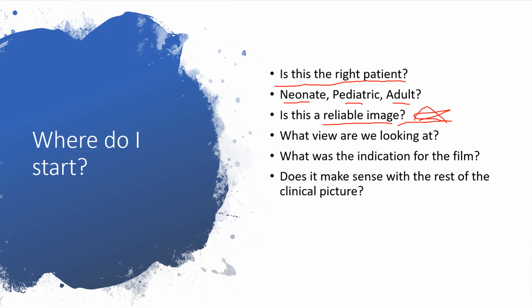A portable chest X-ray is what's considered an anterior to posterior. So instead of the X-rays entering from the back, the spine side, and going through the chest out the sternum side, they actually go the opposite way. When someone comes and takes a portable X-ray, an AP, anterior to posterior, the X-rays penetrate from the sternum and go through to the spine, and the cassette is behind the patient's back.